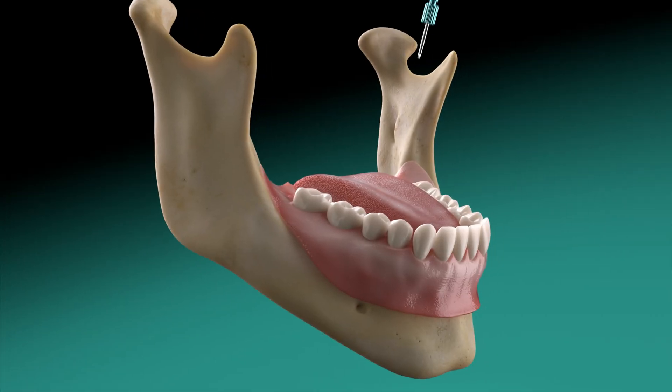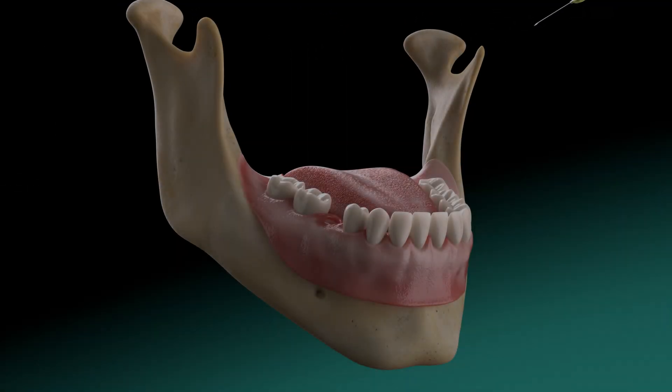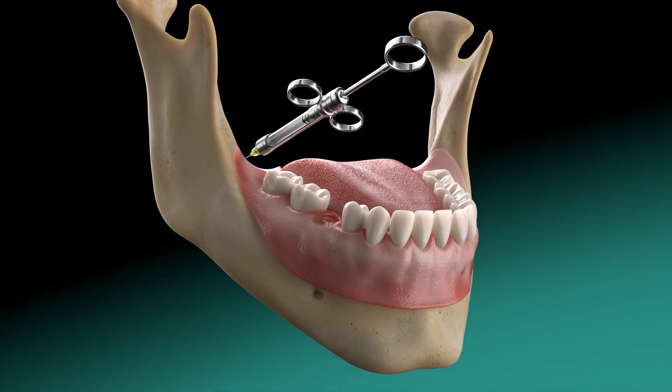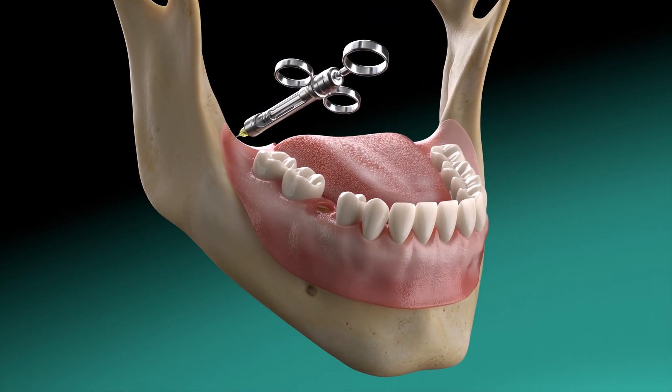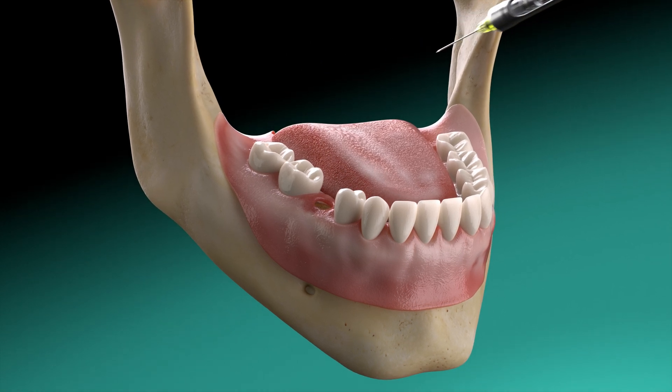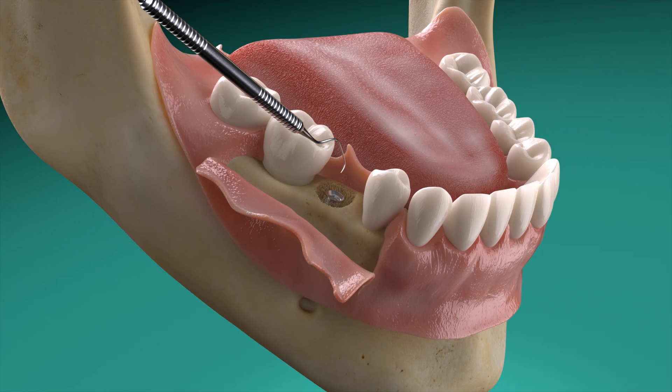Galvosurge's application is simple. Remove prosthetic components and administer local anesthesia. If the implant is in the posterior mandibular area, apply block anesthesia. Conduct flap elevation, then remove granulation tissue and calculus.